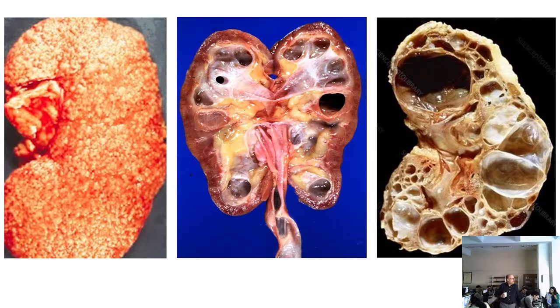because if not treated properly, it may cause chronic pyelonephritis, the terminal stage of which is hydronephrosis. This is another category of diseases destroying the whole kidney in this way. Note that it is different from polycystic disease. Here we have multiple cysts replacing the renal parenchyma. Here we do not have cysts, we have cystic dilation, extreme dilation of the pelvicalyceal system.